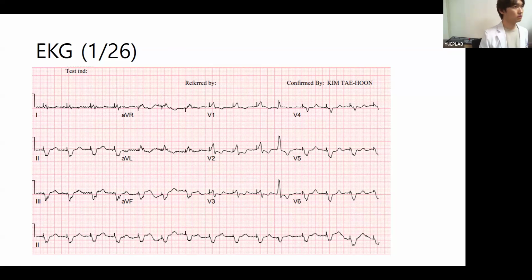So nowadays CSP, conduction system pacing, is very popular, and I quite often see a very narrow paced QRS after CSP. But after CRT-D, come on. Even though the QRS width is narrower than before the procedure, CRT-D is still a class 1 indication for HFrEF, but CSP is a class 2a indication. So I would like to have your thoughts about the future of the device.